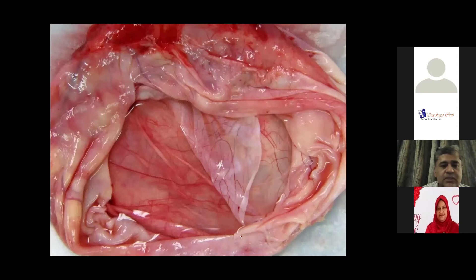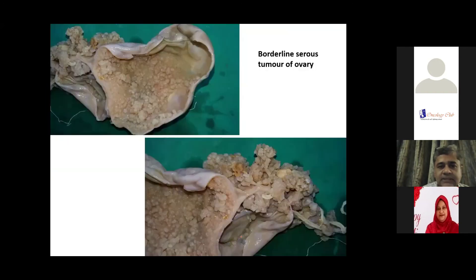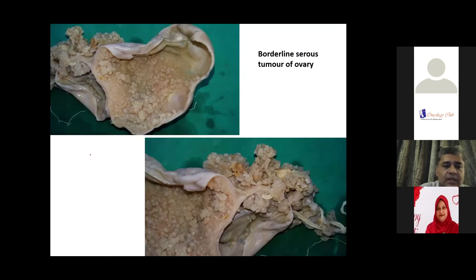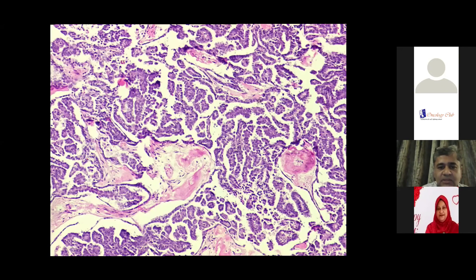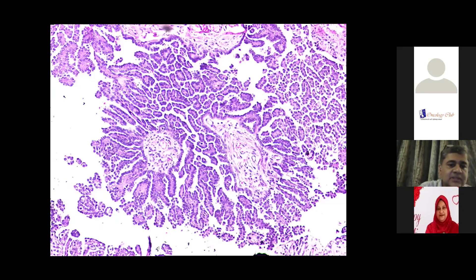This is a borderline serous tumor with a low-grade serous area — this is how a low-grade borderline serous tumor and low-grade serous carcinoma look under the microscope. You have a lot of fronding and papillae within them, with micropapillary appearance — very long, slender papillae arising from them — a micropapillary pattern. And these are the omental implants, which are invasive implants in this case.